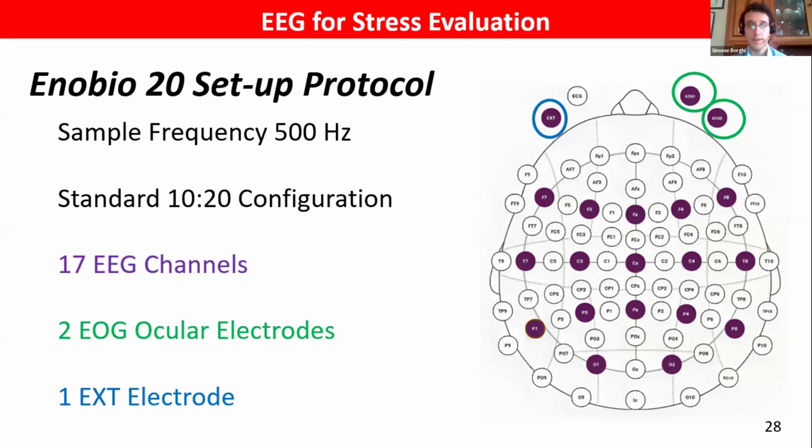We use a cable connection and the NIC2 software connected with a different software, iMotions. This software allows synchronization of different biosensors such as Enobio and exports a raw synchronized CSV file for signal recording with their respective sampling frequencies.